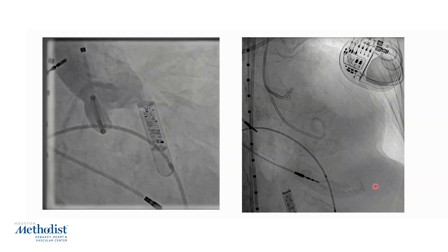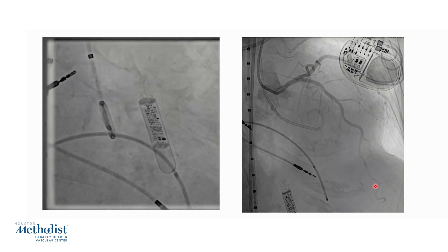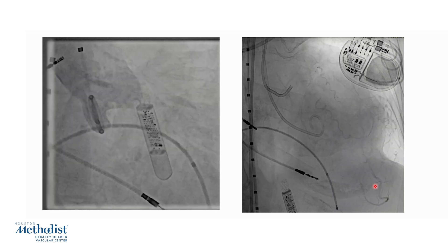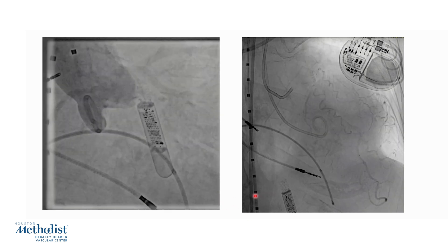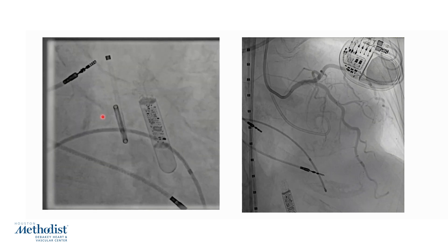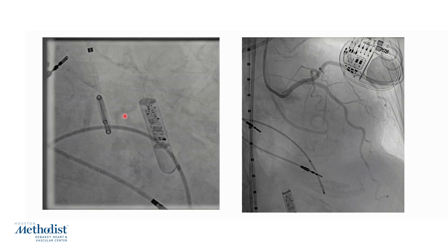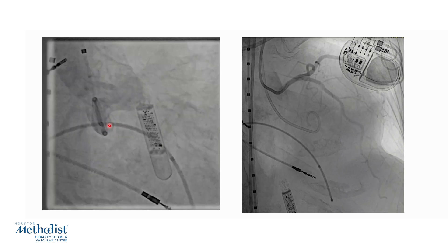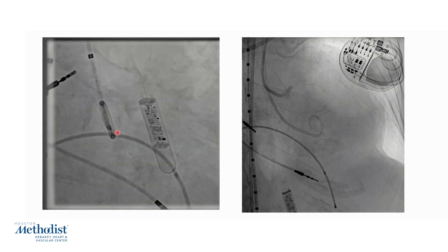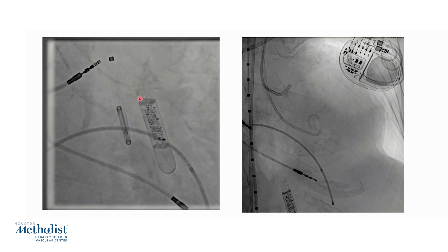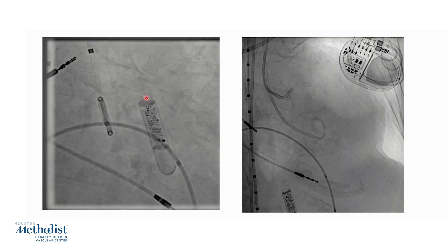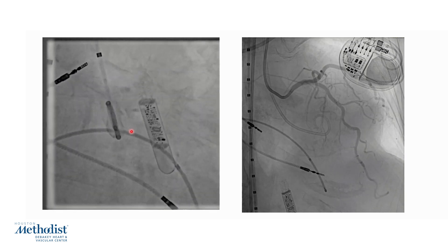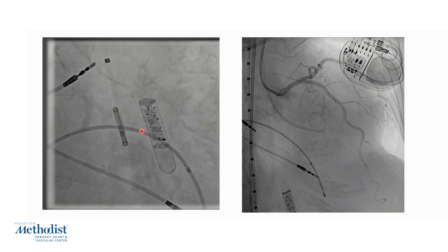Here is the procedure: a routine TAVR with access in bilateral femoral arteries and a pacemaker into the right ventricle. The patient already has a pre-existing pacemaker. A pigtail catheter has been placed in the non-coronary cusp, and this is the aortic root angiogram in the cusp overlap angulation. Cusp overlap isolates the non-coronary cusp with the pigtail in that cusp, while the right and left coronary cusps are overlapped, showing the nadir of the non-coronary cusp — the view in which we deploy the valve.